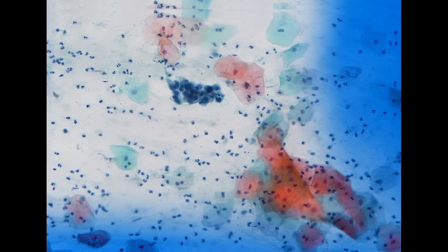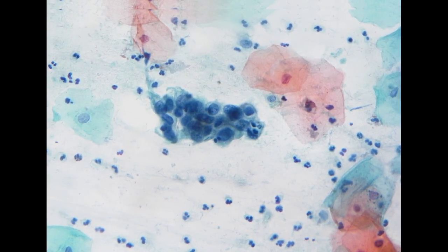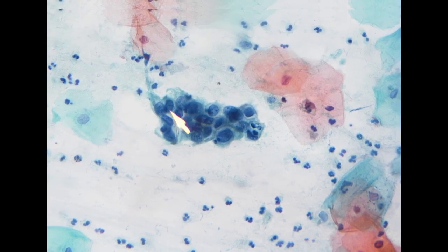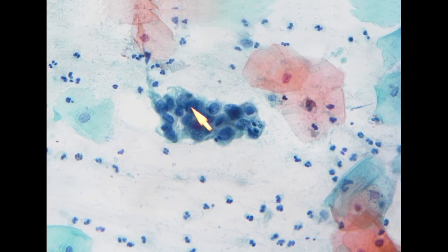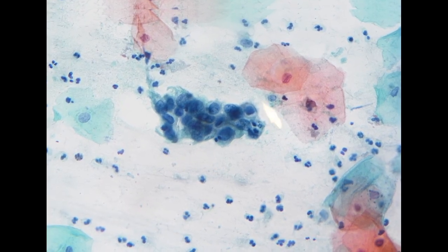Along the smearing direction, this is the good thing about the conventional smear: if you find the lesion, most of the time the lesional cells will shade along your smearing direction. So this is what we call a tight hyperchromatic crowded group, right? Hyperchromatic, it's very blue, crowded, so the cells are overlapping with each other and arranged in a group.